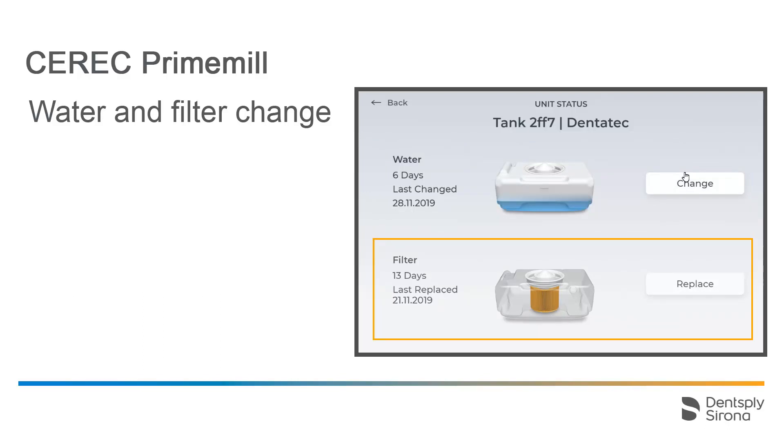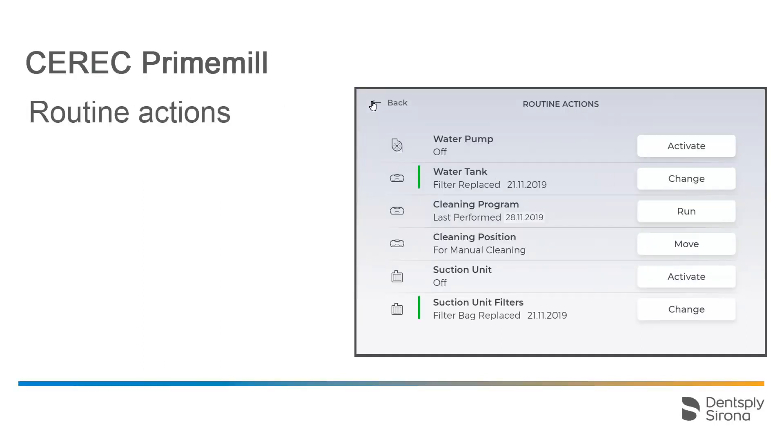The water tank filter insert should also be changed on a regular basis. It should be changed at least with every fourth change of water. Detailed information on how to perform a water and filter change can be found in the video tutorial of the same name. We tap on the Back button, which takes us back to our Routine Actions submenu.